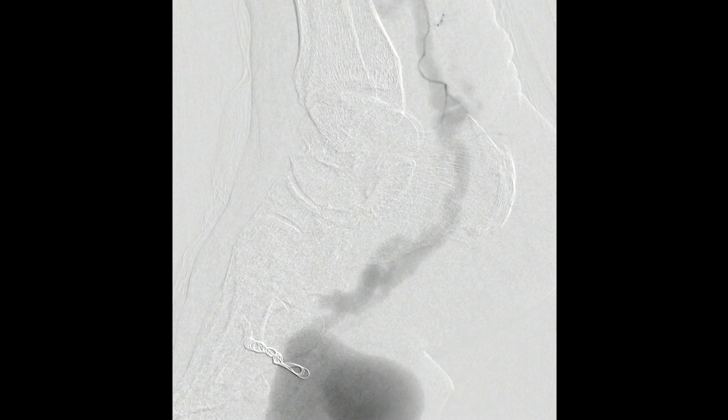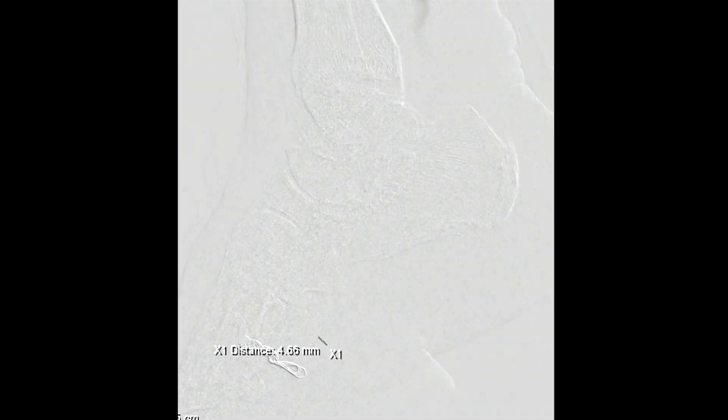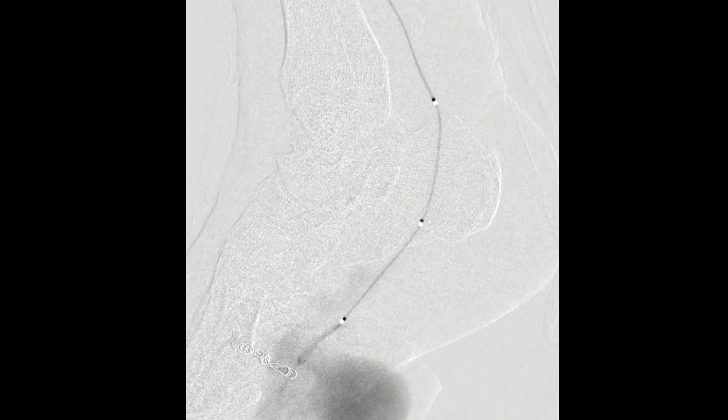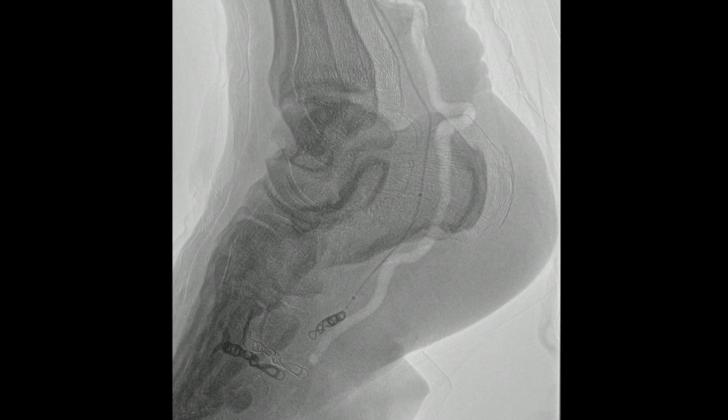We then moved onto the posterior tibial artery. That hairpin bend proved not to be any issue. The advantage here is that the vessels are huge, so we crossed it pretty easily. This patient also had some lipodermatosclerosis, presumably from the venous hypertension which exists. Using the directional microcatheter again, we opted to deploy coils — first 6mm diameter coils.